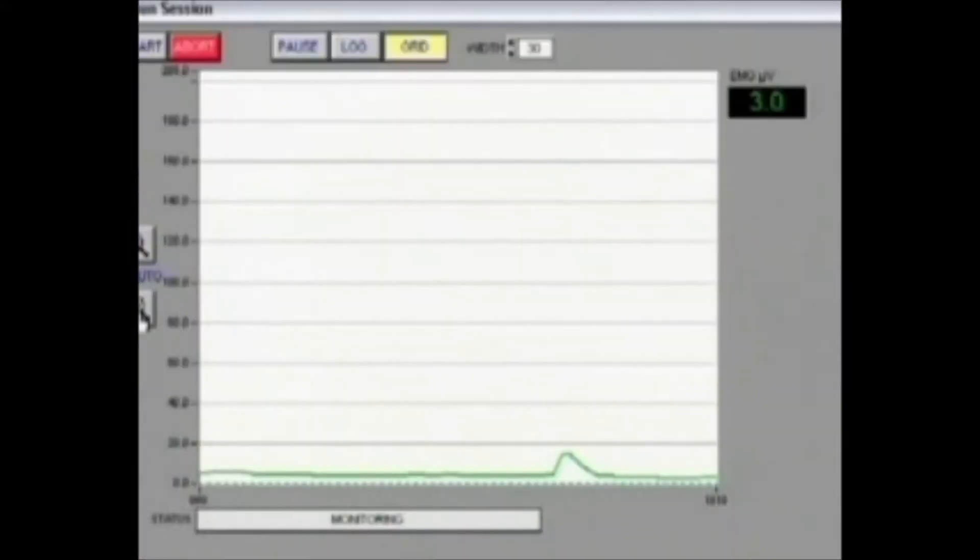Belinda, get nice and relaxed — head back and let the jaw muscles relax. You can see that the printout on the screen is around 2.8 to 2.9 microvolts, measuring the amount of muscle activity happening in the clenching muscle region. So Belinda, I'll get you to have a clench as hard as you can go — this is just on your own natural teeth.